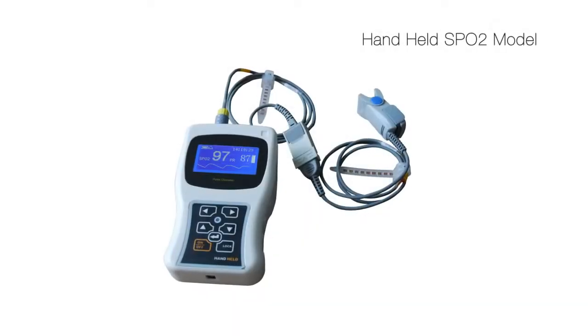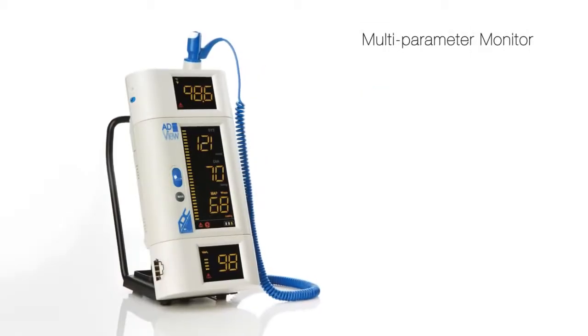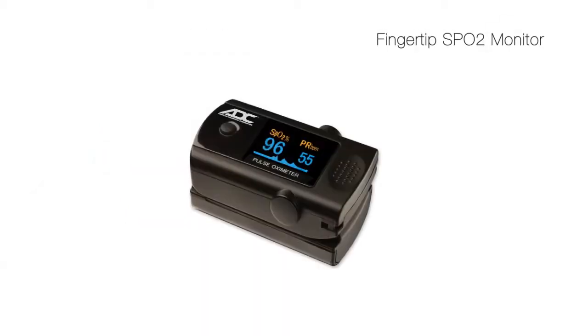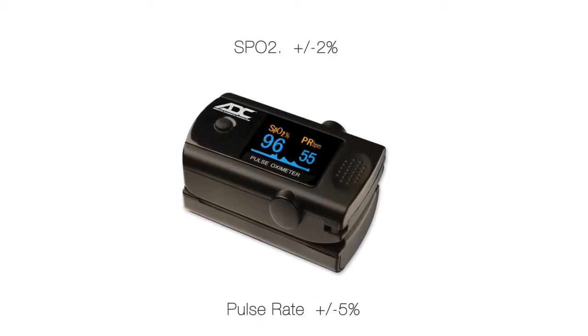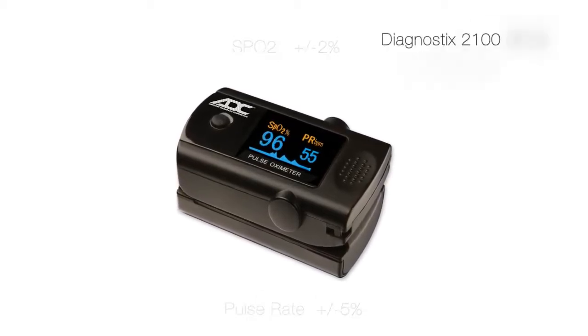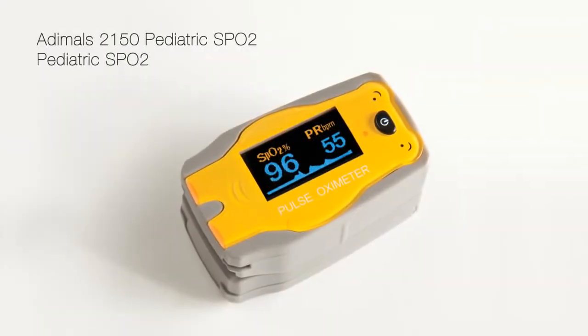Pulse oximeters are typically found in hand-held instruments, multi-parameter monitors, and ultra-compact fingertip models that combine the sensor and display in one unit. ADC pulse oximeters are extremely accurate and among the industry's most popular. ADC offers a number of fingertip models for professional and consumer applications.